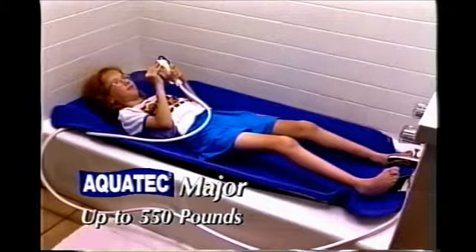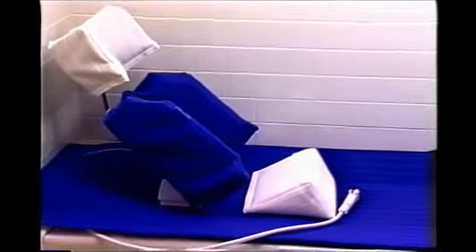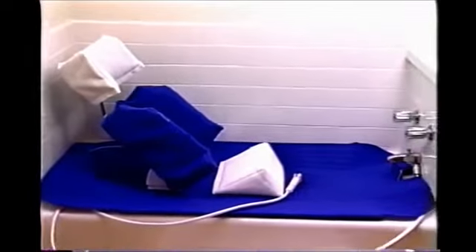The Major can lift 550 pounds. The custom-made Major is built to the specifications of your tub to assure a proper fit.